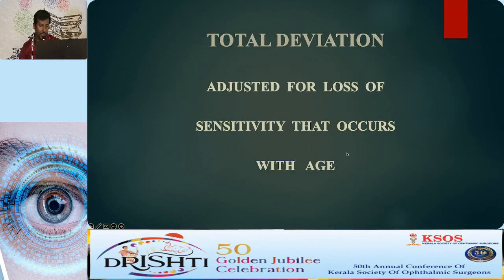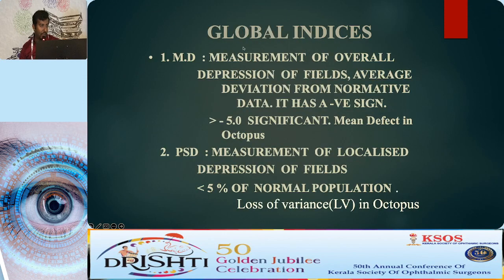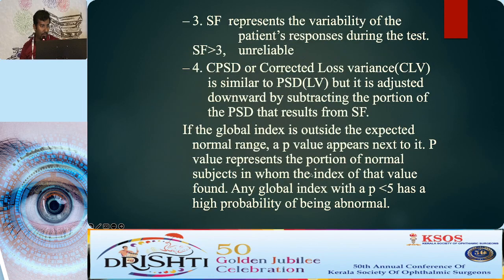And you adjust for sensitivity with age. That is why entering the age is important. And these are the global indices, mean deviation and pattern standard deviation. We'll not go into the details of that right now.